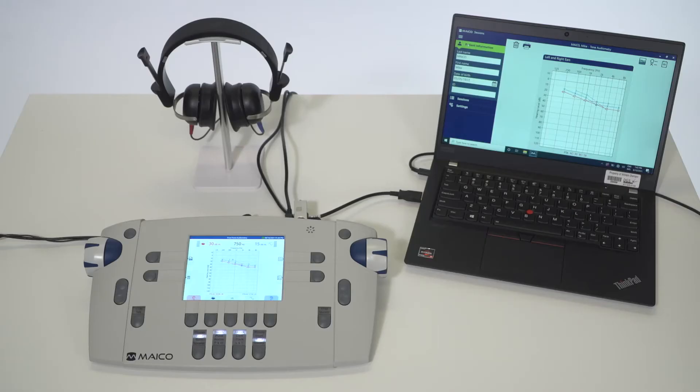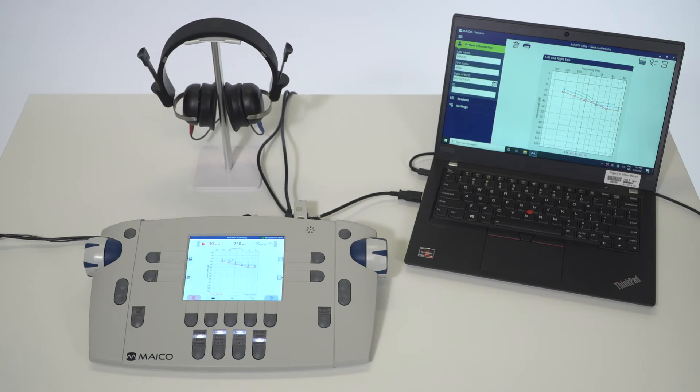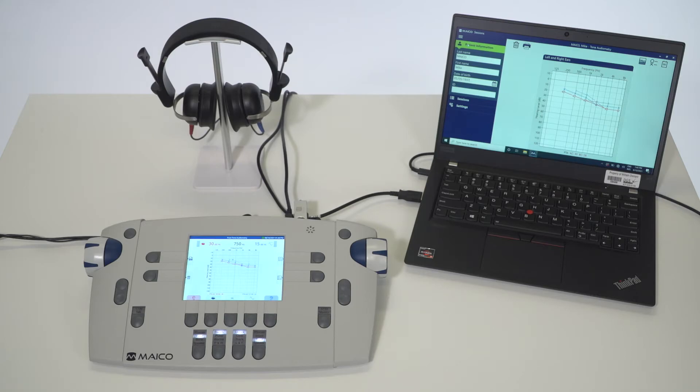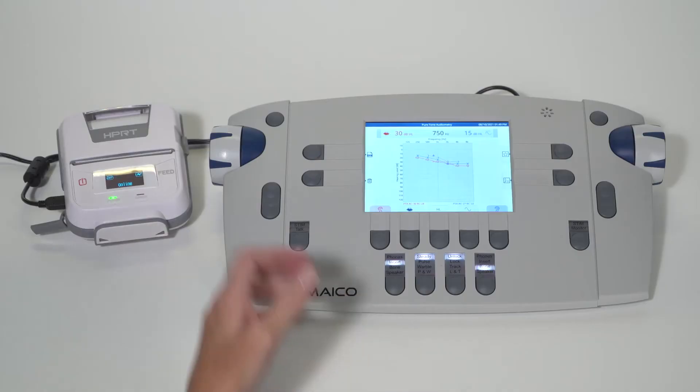The unit can be used in conjunction with the software module MAICO Sessions. MAICO Sessions can be used as a standalone software for printing to default printer or to a PDF, or it can be loaded into a database. Database options are OtoAccess or Noah. This will allow for test results to be stored and later recalled or printed.